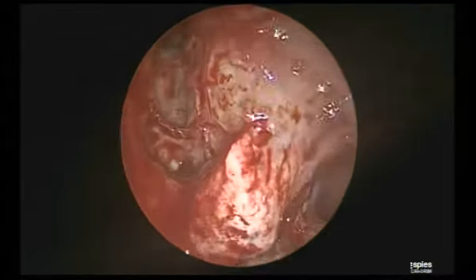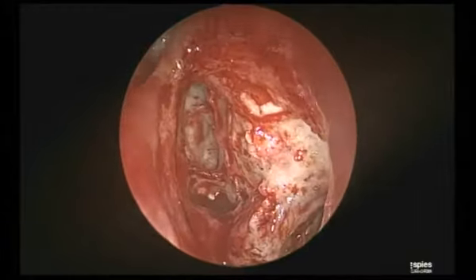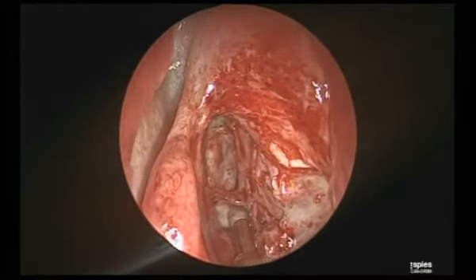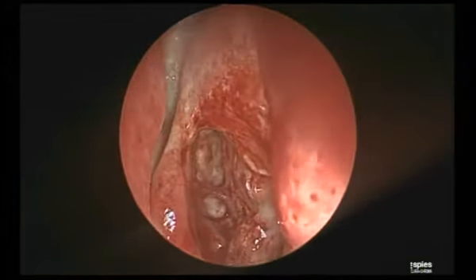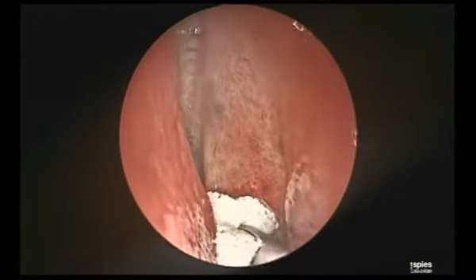Now, reverse. Another important blade which I am going to show you, which I work at the skull base, is the adenoid blade. Believe me, I call it a skull base blade, never used for adenoid. I condemn this blade being used for adenoids. That's a rear facing blade. Then why did you buy it for adenoids? Never. I never use it for adenoids.